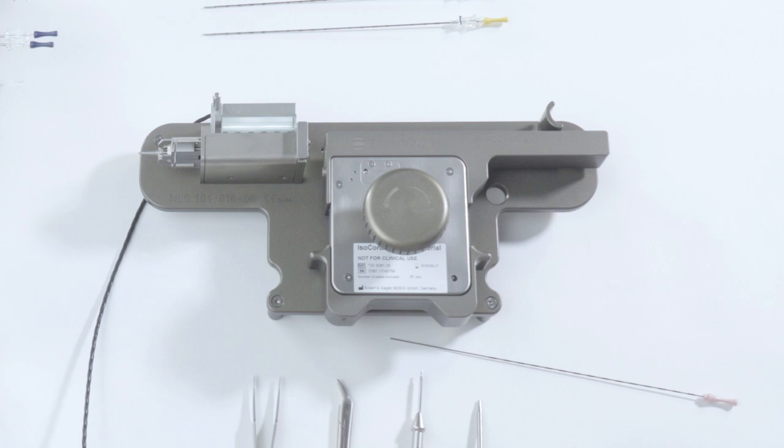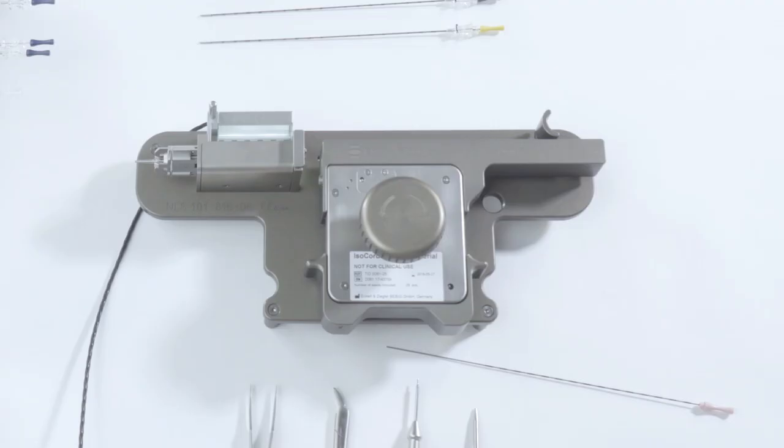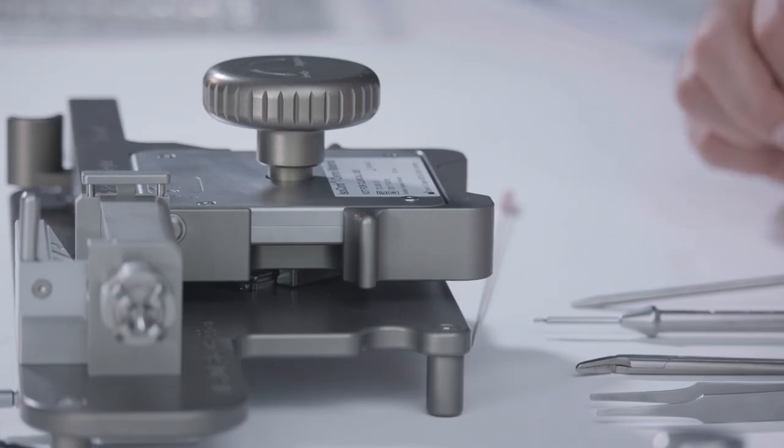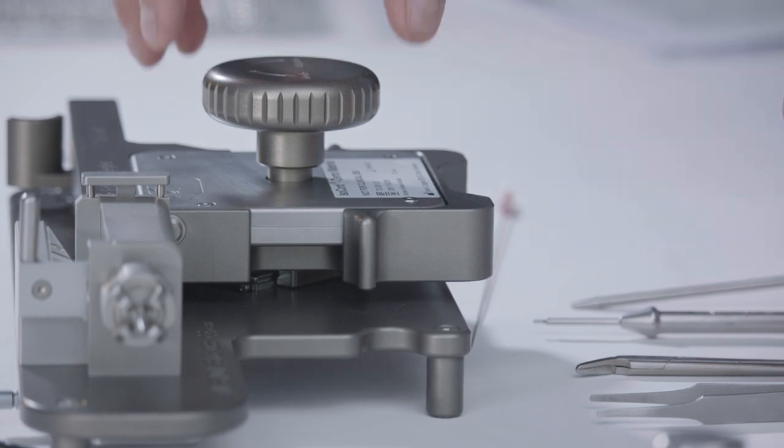When all seeds have been ejected from the magazine or you have prepared all the needles you required, move the magazine holder into the mandrel position. Turn the knob clockwise in the direction marked magazine until the end of the chain is flush with the socket on the magazine holder.